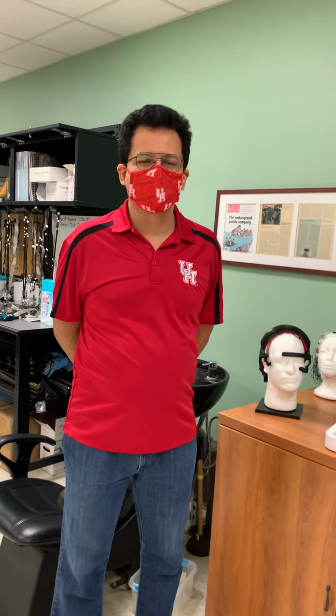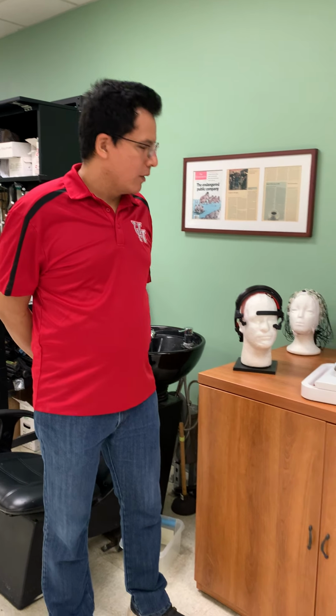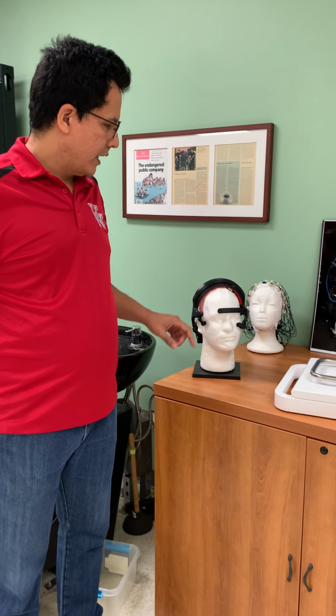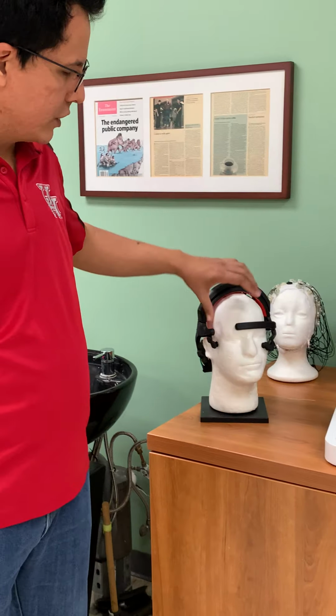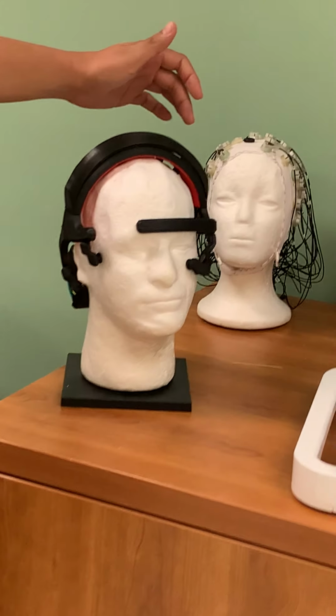Hi, my name is Juan Jose Gonzalez Espana. I'm a second-year PhD student in Pepe's lab, and I'm working on the design and development of an EEG amplifier for dry electrodes, which can be used in virtual reality, gaming, via IoT, and in particular is being used right now in the integration with the robotic system for rehabilitation on the NeuroExo project. And we can see here where the EOG sensors are over the face, while the EEG sensors are over the sensory motor area.